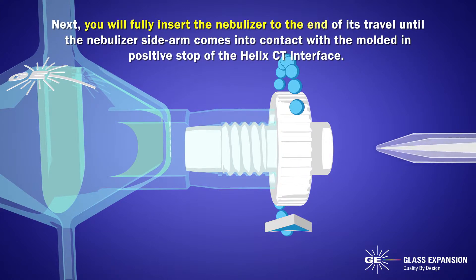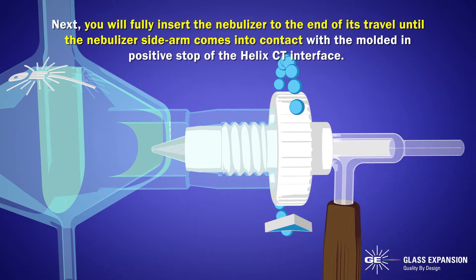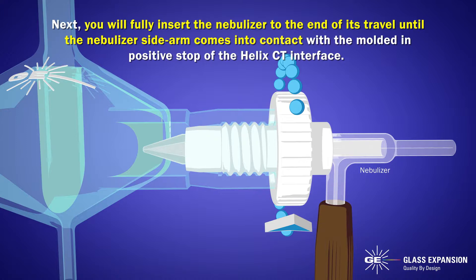Next, fully insert the nebulizer to the end of its travel until the nebulizer sidearm comes into contact with the molded-in positive stop of the Helix CT interface.